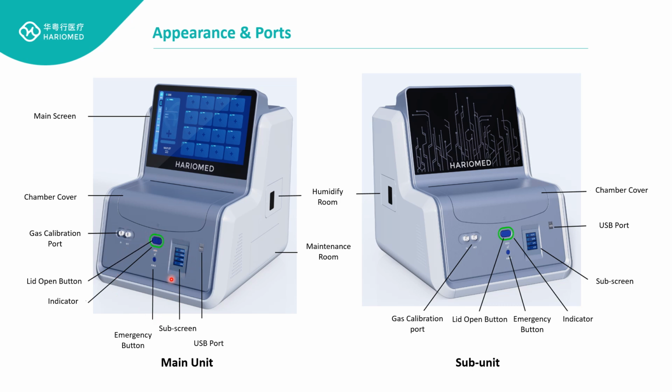And here is the subscreen. And on this side, we prepare a gas calibration port. And for the subunit, all components are the same except the main touch screen. So all the touch screen information can be operated on the main screen.